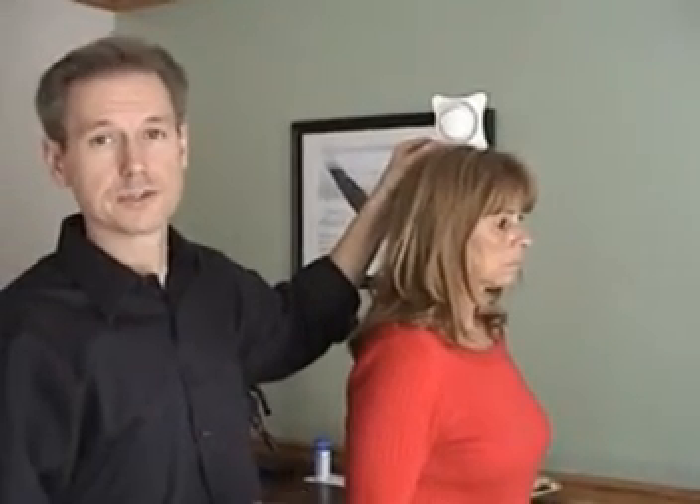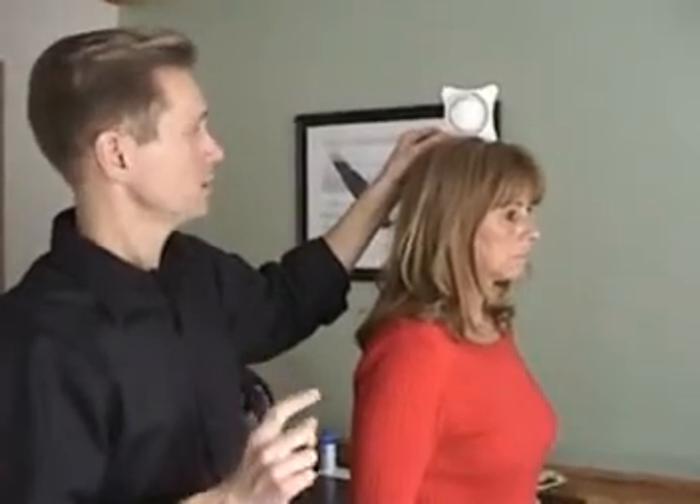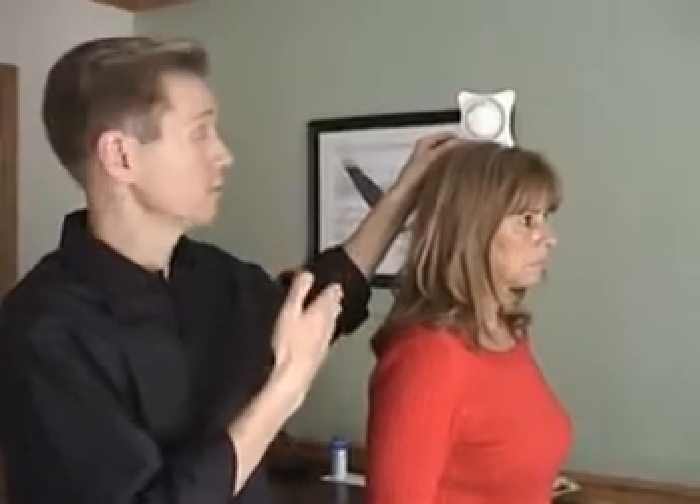Hi, I'm Doug Nelson and thank you for your interest in the range of motion cervical inclinometer. The inclinometer is really wonderful to be used for different ranges of cervical motion.